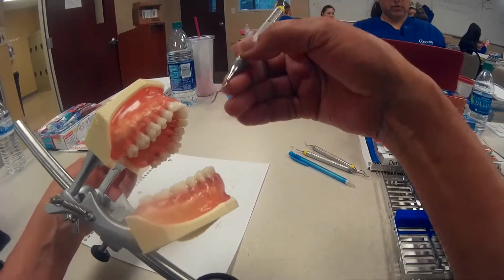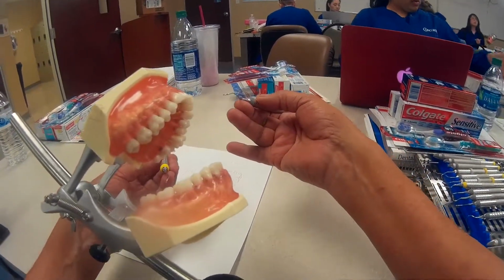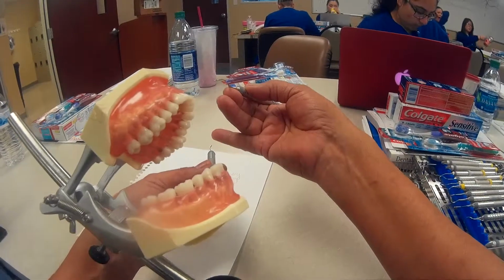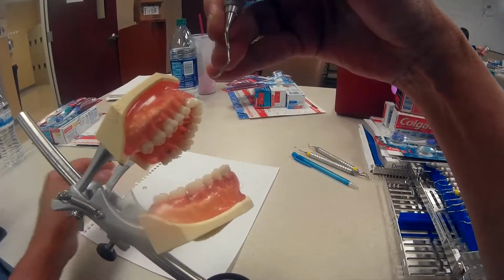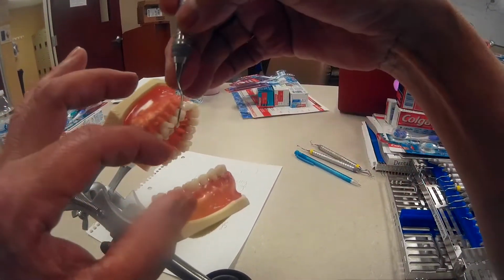Because when a surgeon picks up a scalpel, don't you think he picks it up and looks at the end and makes sure he's got the right end? I don't know. Call me crazy, but that's kind of how we learn to make sure we're doing the right thing. So again, here's my correct end.